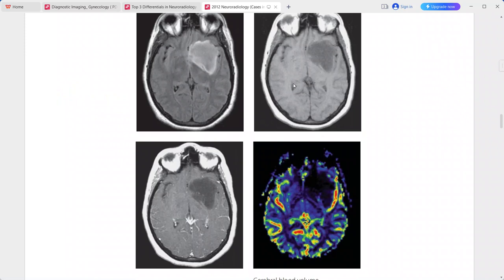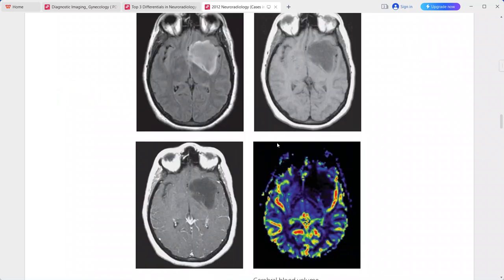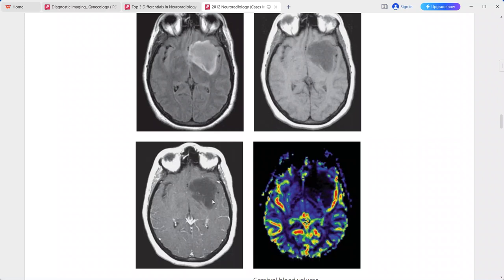On T2-weighted MRI, the mass is hyperintense. On the post-contrast sequence, there is no significant enhancement. On the FLAIR sequence, the mass is hyperintense.